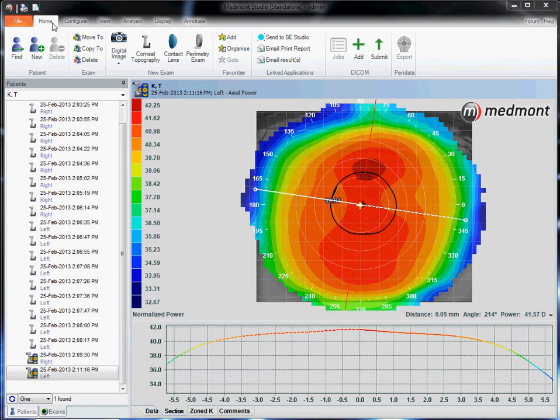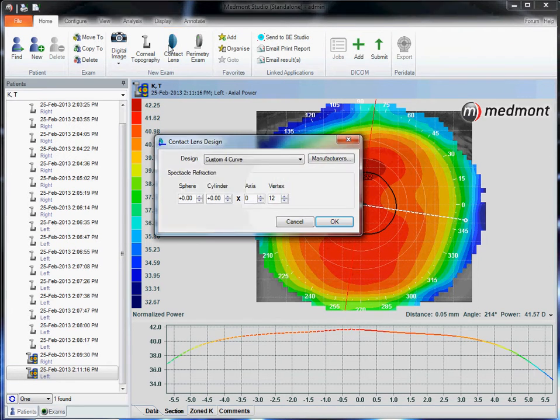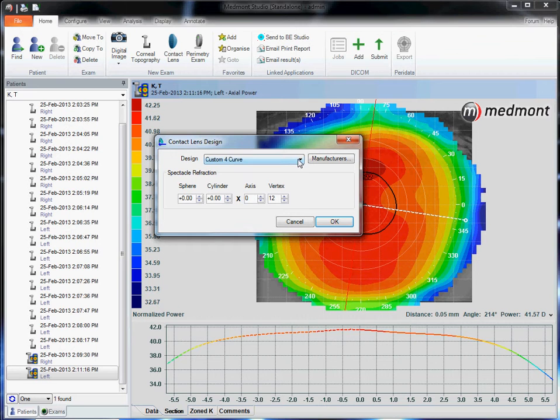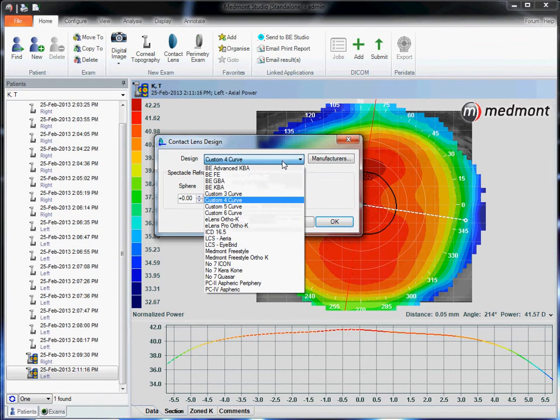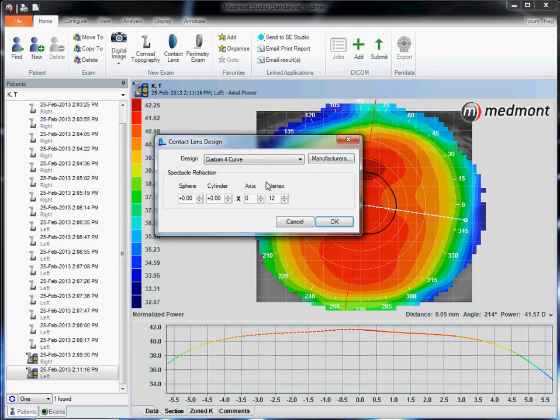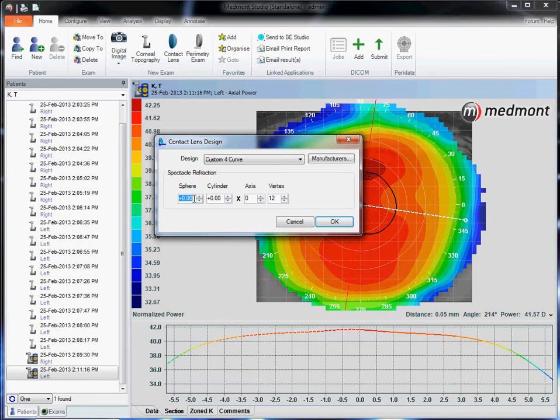Go to home and contact lens. Then choose from the lens option the design that you prefer. In this case, under this pull down menu we've selected the custom four curve. We can enter in the SpectacleRx here if we haven't done it on the patient window.